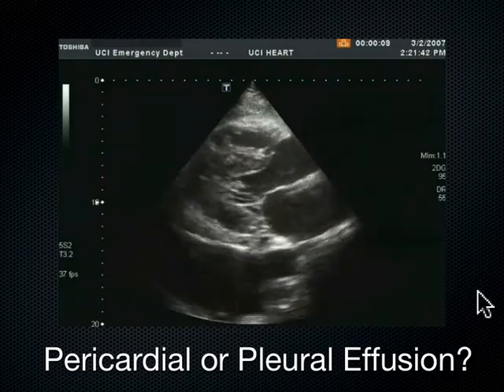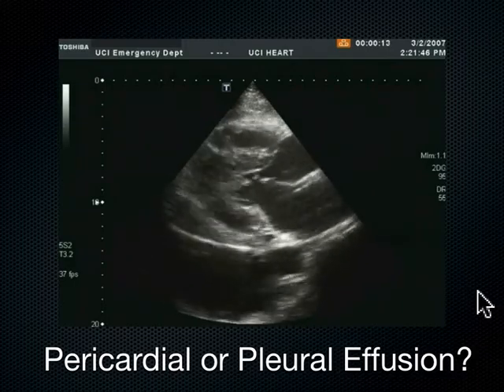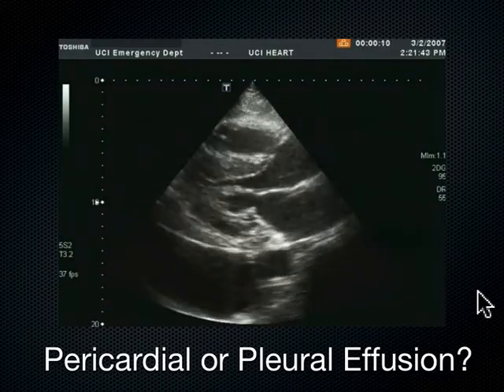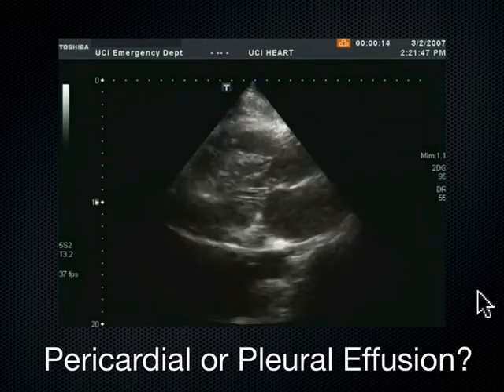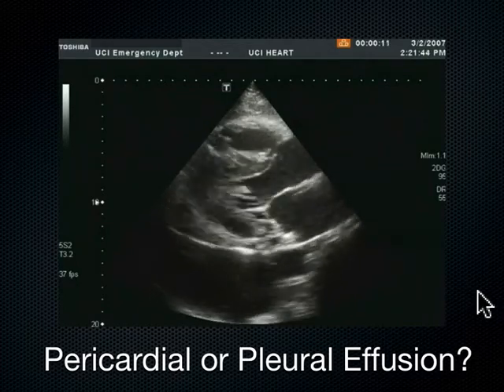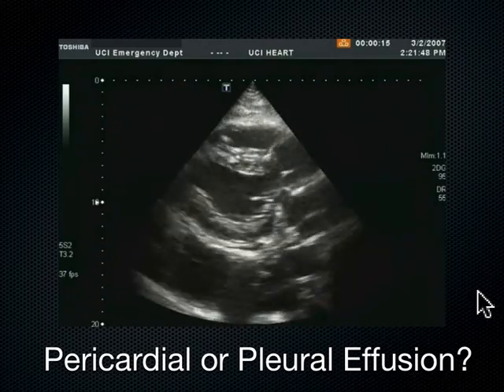If it wasn't for that descending aorta, how do I normally diagnose a pleural effusion on the left? Simple. I go into my FAST exam window, looking at the spleen and the diaphragm. I look superior to the diaphragm. If I don't see the mirror image artifact of the spleen up in the chest, if I see all this black stuff on top of the diaphragm, looking coronally, laterally with the P21 probe, then I know, with the same probe I'm using for this, that confirms to me that this is pleural.